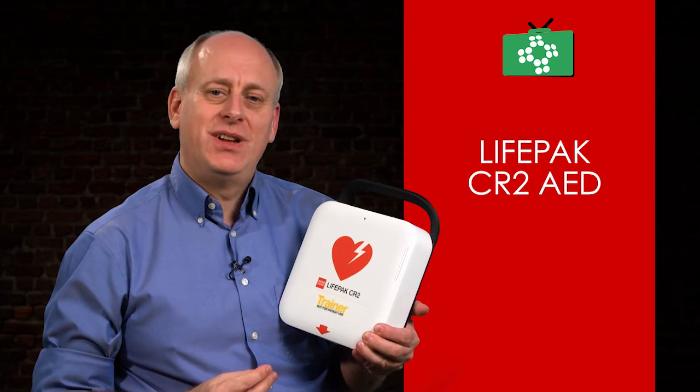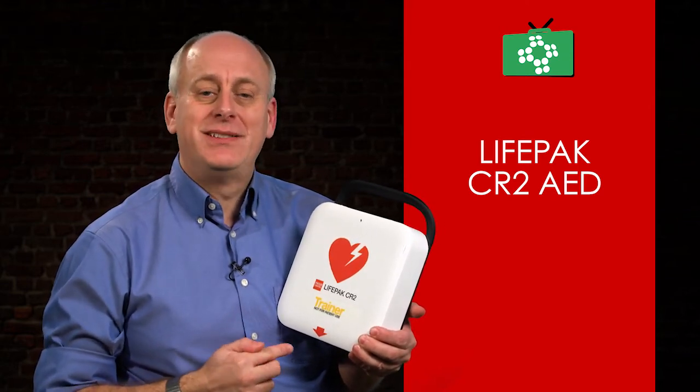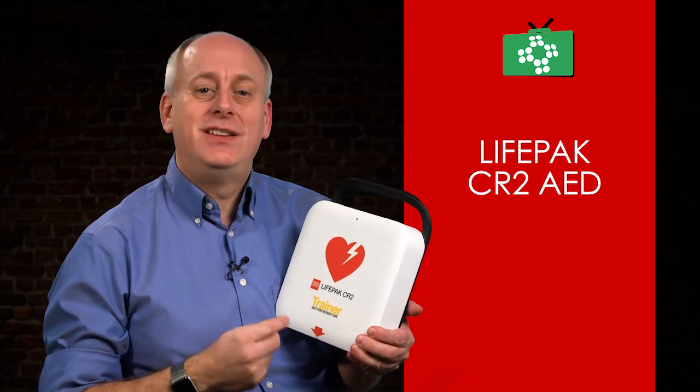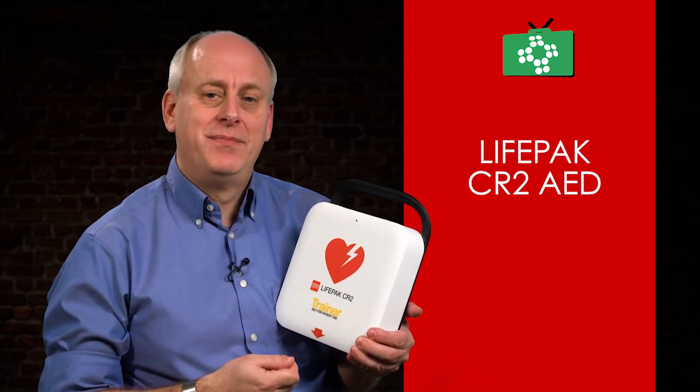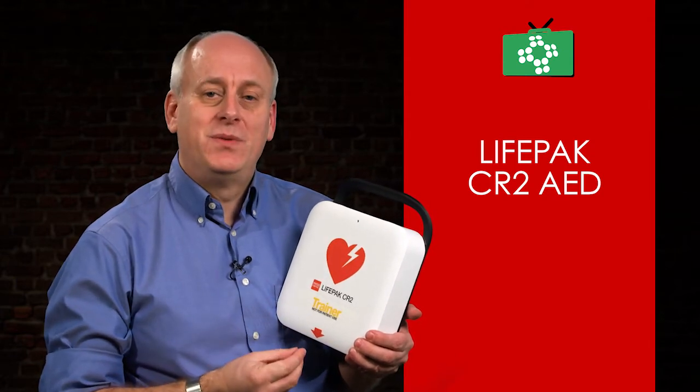Welcome to this edition of the First Aid Show. The LifePak CR2 is a little different to other AED units, having advanced features in addition to those of a standard unit. It's also available as fully automatic or semi-automatic models.